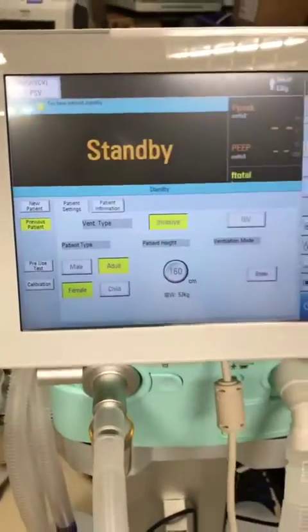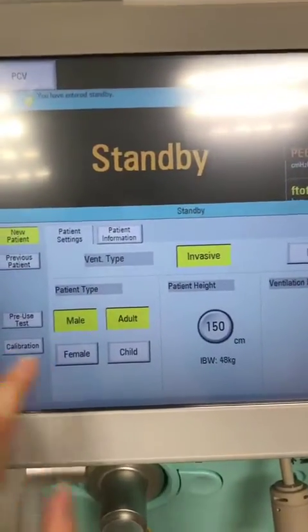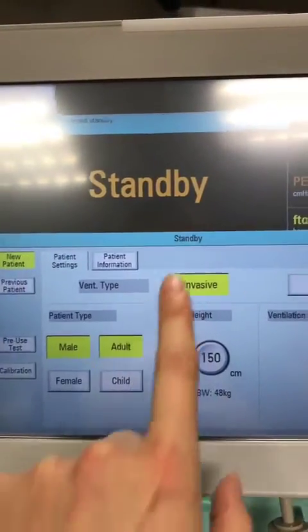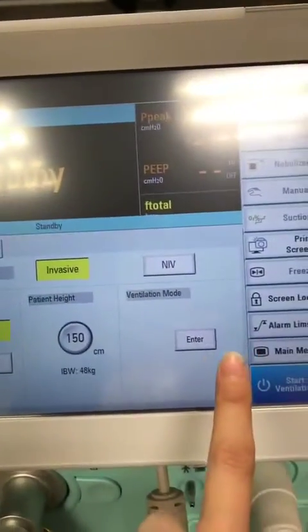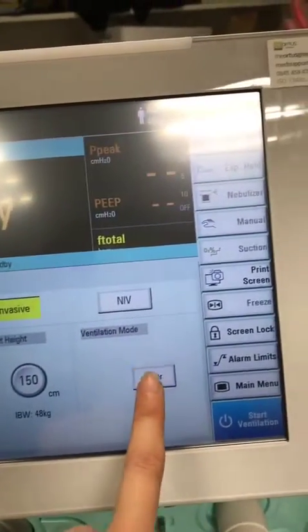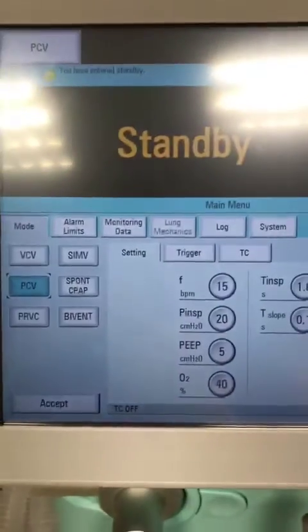The screen here shows the setup for a new patient — you specify male or female, adult, invasive or non-invasive, what you're going to use it for, height, and then ventilation mode. You can go through this way to set your modes.